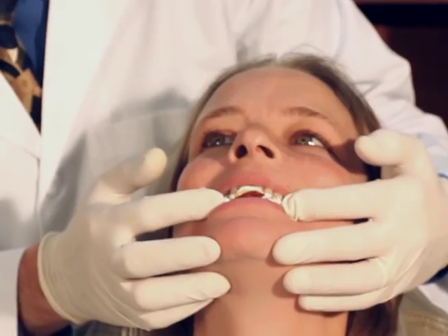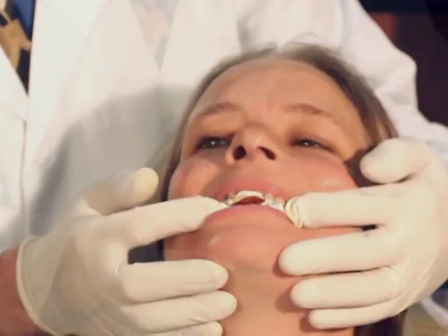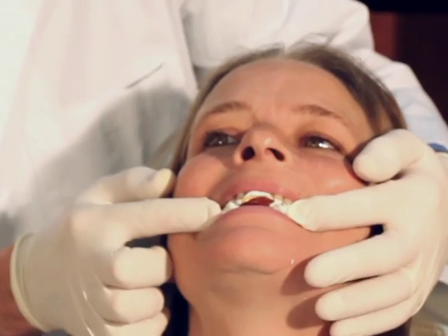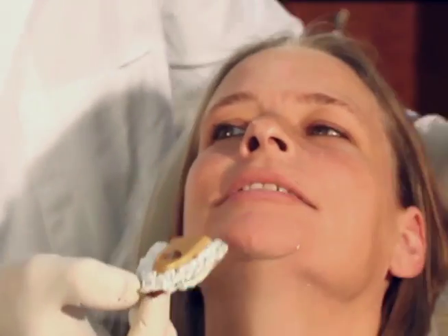We hold this tray against the upper teeth, making sure they don't clench too much but yet making sure the jaw doesn't relax and separate from the tray. We'll hold this in place until the material sets. Once the material sets, hold the tray against the upper teeth, have the patient open their mouth — it separates from the bite tray. We can now remove this.